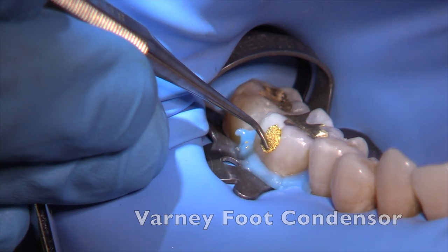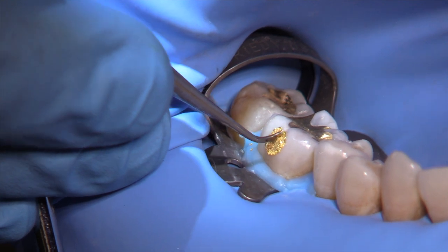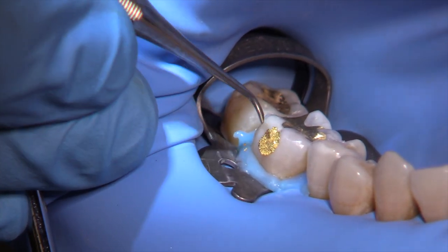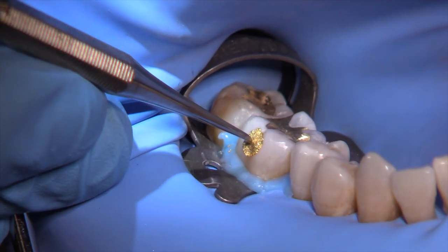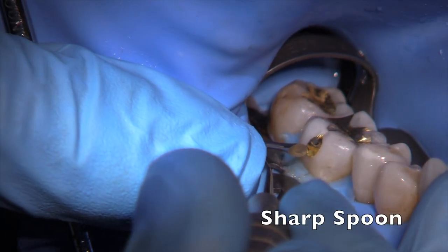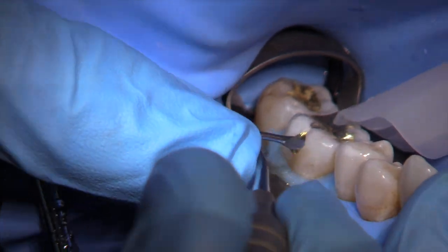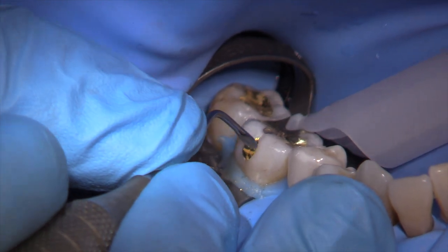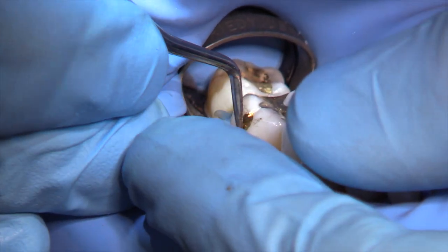We're now at the final layer where we'll use a Varney foot condenser to confirm adequate contour and seal at the marginal interface. Notice how the tip of the Varney foot is pushing away from the center towards the margins. This entire procedure takes no more than about 20 minutes. We're now going to use a sharp spoon or cleoid-discoid to remove excess gold beyond the margin, keeping the instrument on both enamel and gold simultaneously. Another helpful instrument is the Spratly knife, which can also burnish the surface and initiate a harder outer surface.